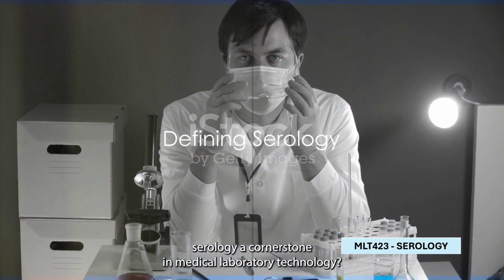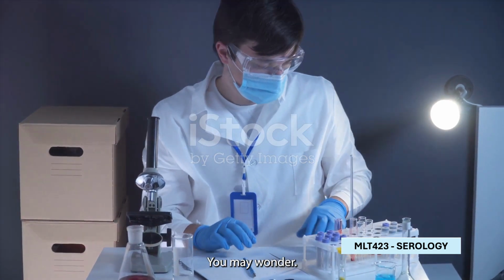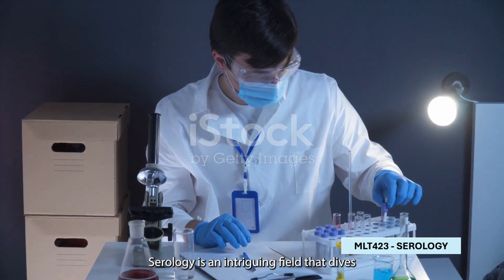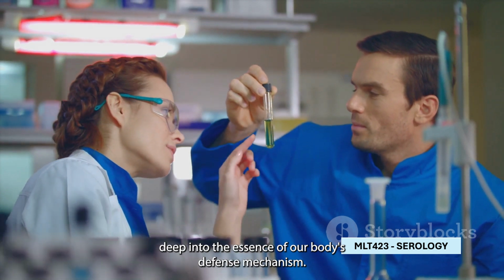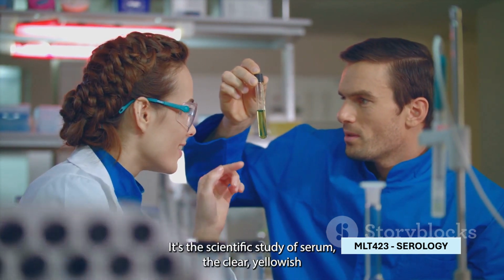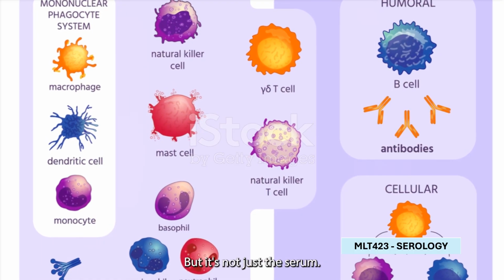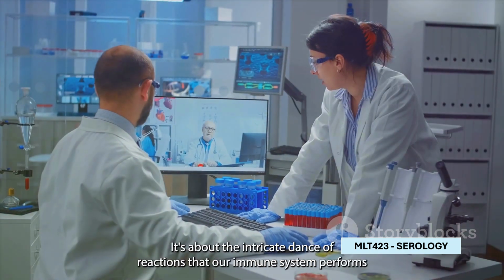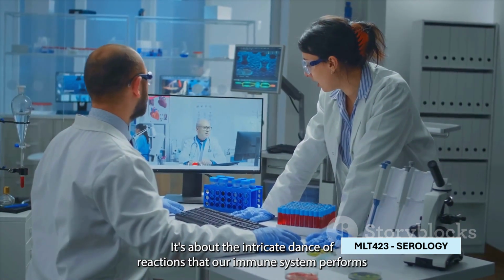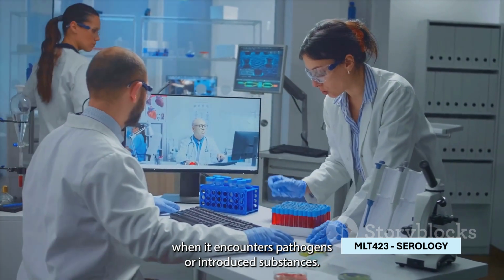Why is serology a cornerstone in medical laboratory technology, you may wonder? Serology is an intriguing field that dives deep into the essence of our body's defense mechanism. It's the scientific study of serum, the clear yellowish part of blood that remains after clotting. But it's not just the serum. It's about the intricate dance of reactions that our immune system performs when it encounters pathogens or introduced substances.